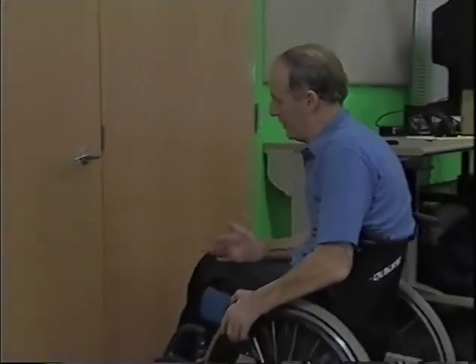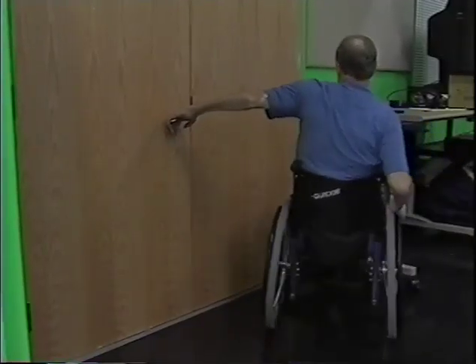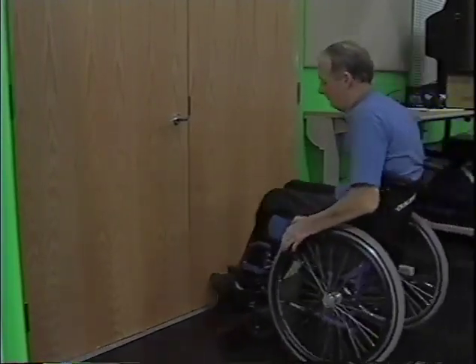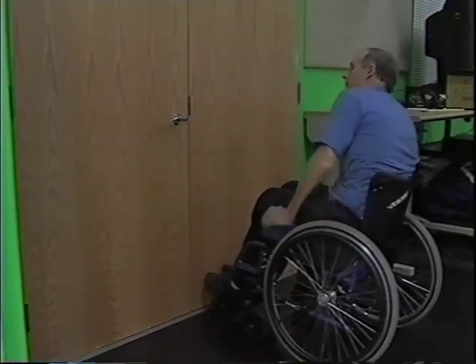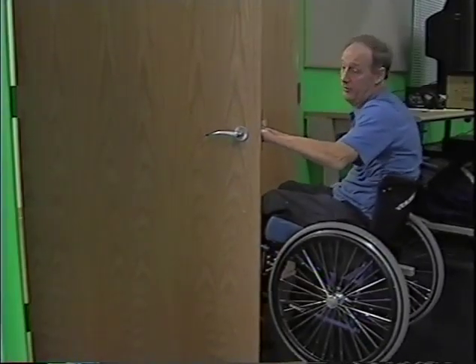When it comes to opening doors, you want to roll up and keep your chair at 90 degrees. Try not to get in a position like this, because when you're pulling on the door, your front end is going to try to go away from the direction you want to turn. So try to keep it at 90 degrees or less. Leave enough room for the door to clear your chair, and lean forward, bracing yourself with your other arm so you don't pull yourself out of the chair.